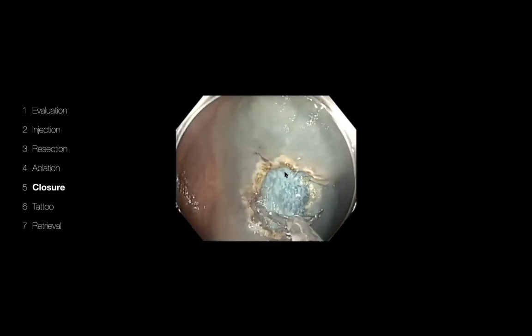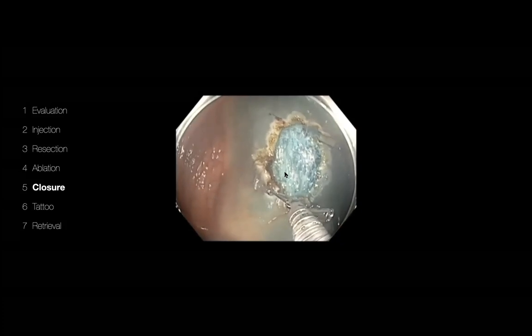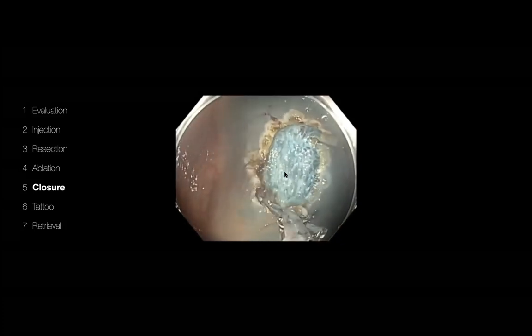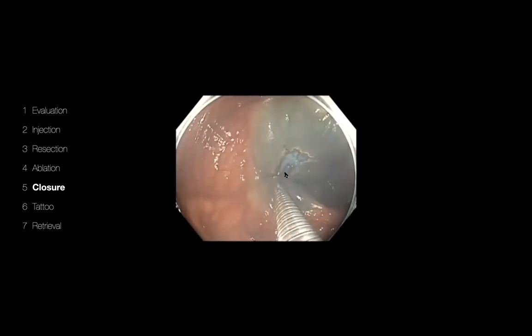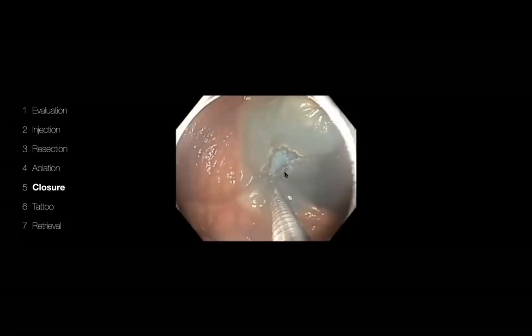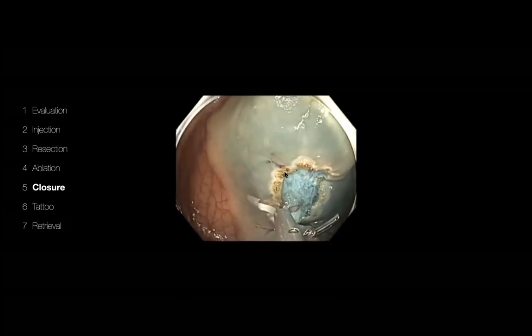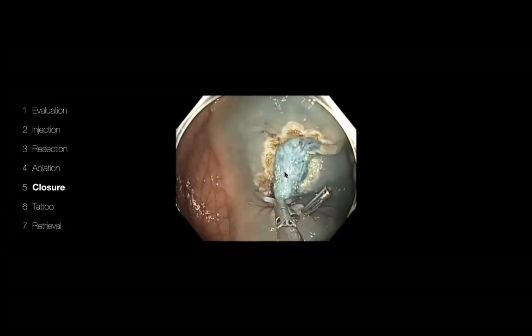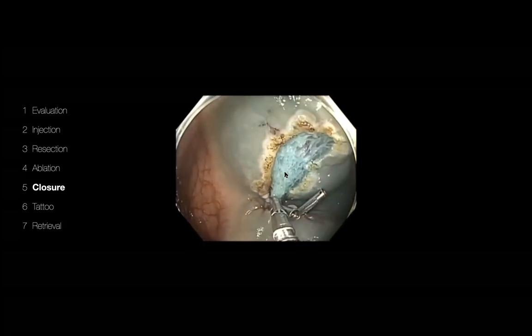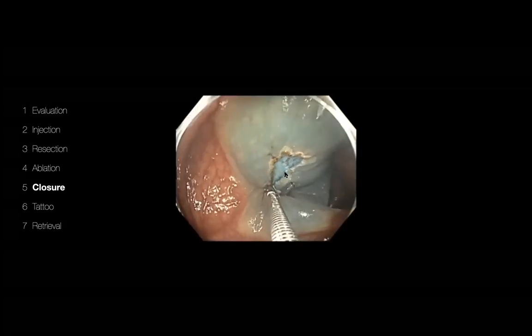And when you have a large defect like this, it probably makes sense to use a clip with a wider opening. This is a clip that can open up to 16 millimeters. So we started with that. But one of the disadvantages of this 16 millimeter clip, I think it is made by Microtech, is that rotation is not necessarily 1-to-1.